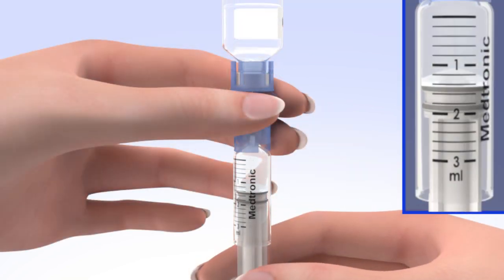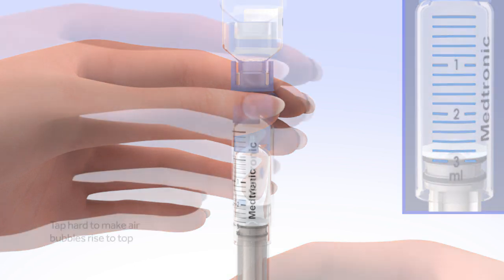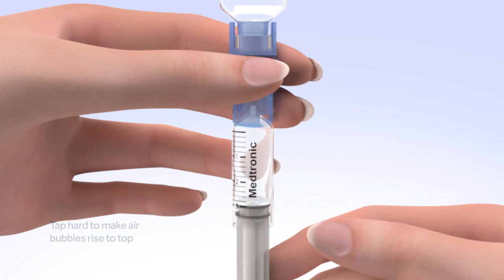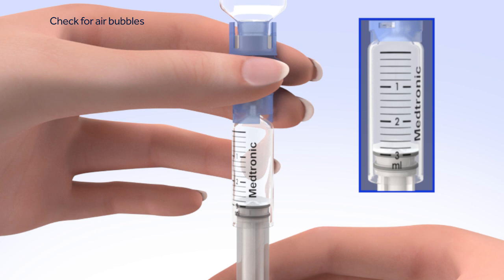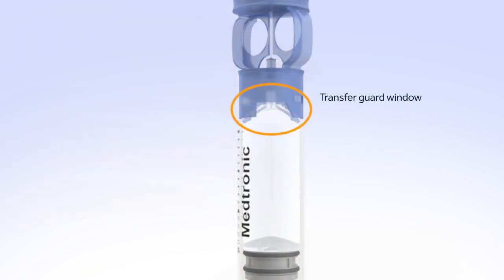Keep in mind, every small line on the reservoir represents about 20 units of insulin. Tap the reservoir hard enough to make the air bubbles rise to the top of the reservoir. Slowly push up on the plunger rod to move the air bubbles back into the insulin vial. Pull down on the plunger to fill the reservoir to the number of units desired. Repeat as needed until air bubbles are removed. Look in the window of the blue transfer guard to make sure no air bubbles remain. Any air bubbles the size of champagne bubbles are normal, so don't worry about these.